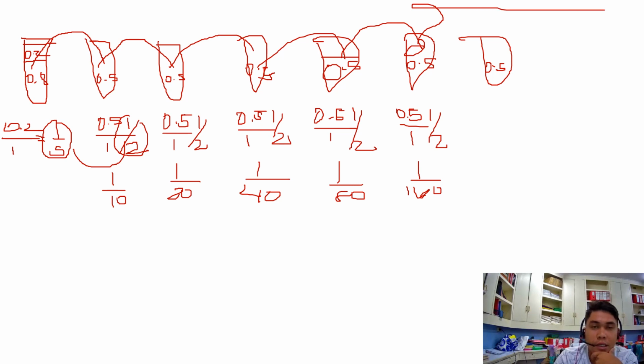Okay, discard. So this one is your negative control. Number 7 is the negative control. No serum. It does not contain serum.